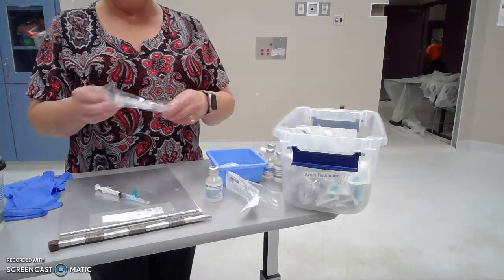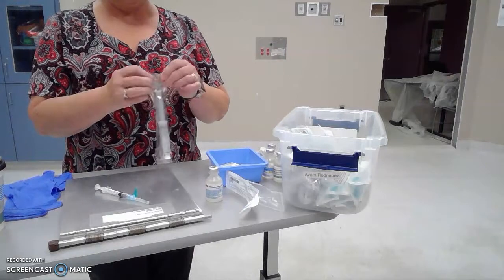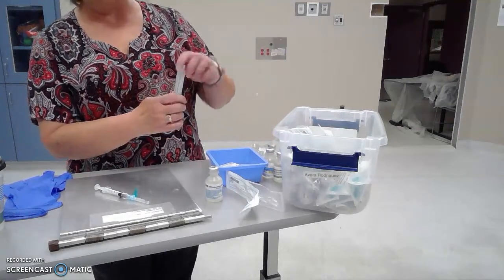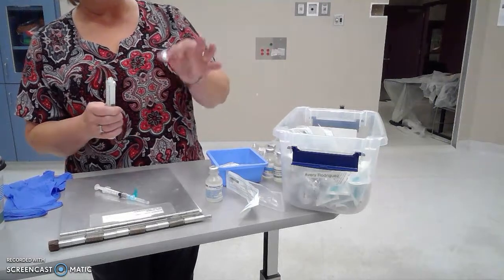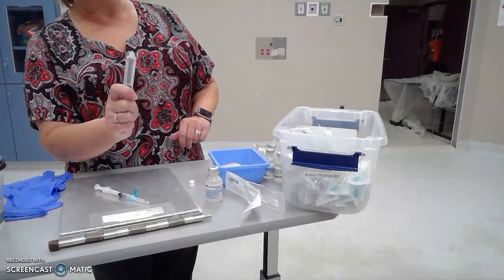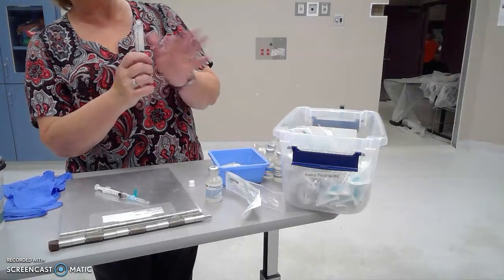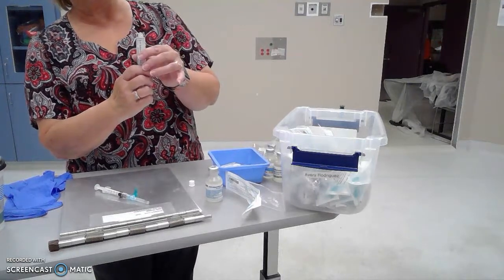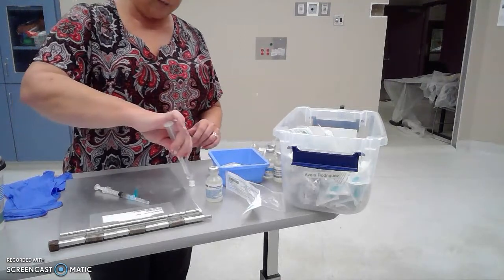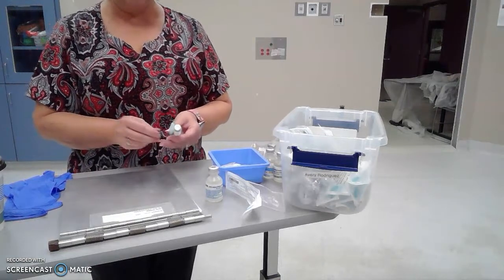I am going to take my saline flush. I'm going to open it. Again, I'm going to take the top off. If you lay it flat on your surface, you'll be able to recap it pretty easy. You pull down to get it started, and then you push up to get all that air out to start with. So I can recap that now this way. And I am going to my patient's room.